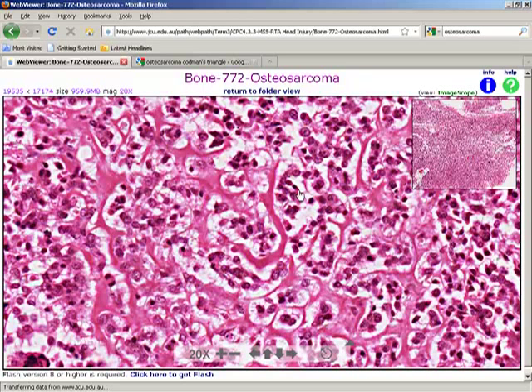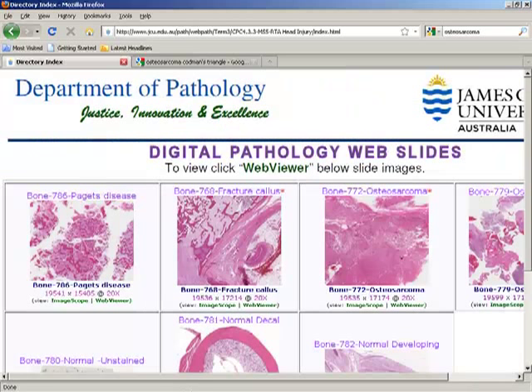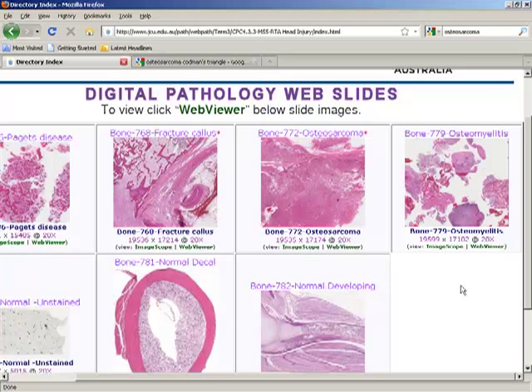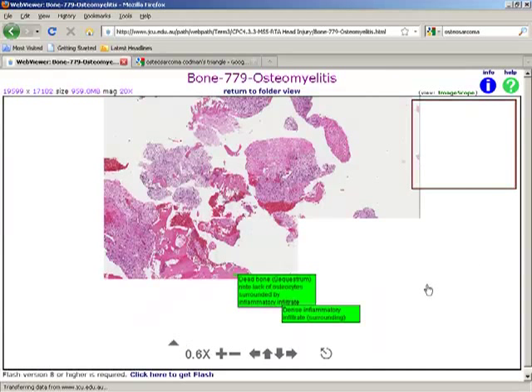They are osteoblasts, malignant, and the fine lacy, okay, lace-like, fine osteoid. That's all the feature, okay, only two. Lacy osteoid and these osteoblasts which are irregular. So, pleomorphic cells. And of course, the clinical history will help you. Microscopy of osteosarcoma.